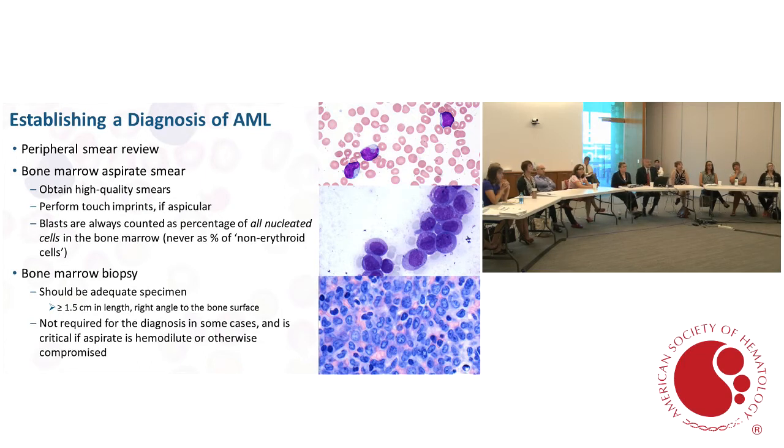So there are some pitfalls in the diagnosis to keep in mind. It's not always that straightforward. We talked about neoplasms with excess blasts. When you have a blast count in MDS and MPN that's approaching 20%, 18% versus 21%, that's always hard to say, and it's quite arbitrary. If it's 21% blasts, I call it AML. If it's 19%, I call it MDS with excess blasts 2. It could be within the standard of error.